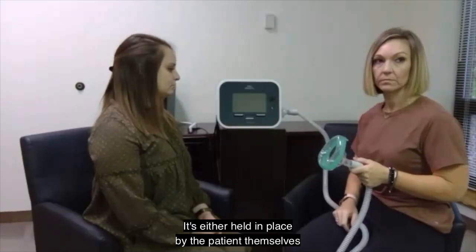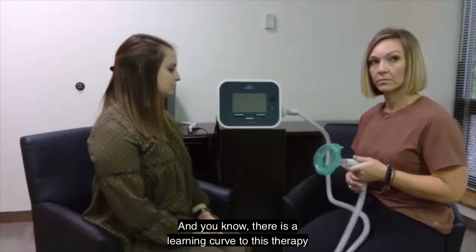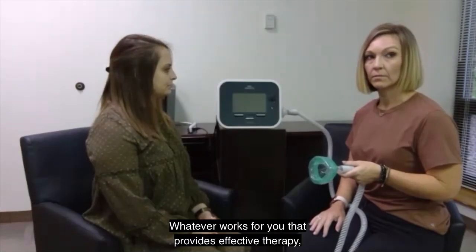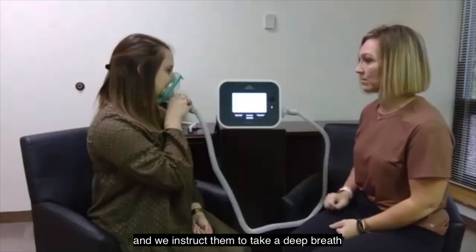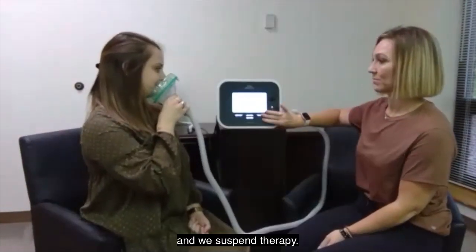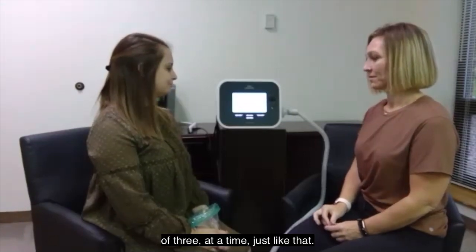We don't strap this on to anybody. It's either held in place by the patient themselves or by the caregiver — either will work. There is a learning curve to this therapy, both in terms of how to use it, when to use it, and what's comfortable. Everybody develops their own sort of methodology. We place the mask on the patient's face and instruct them to take a deep breath and cough out. That's repeated, and then we have them remove the mask from their face and suspend therapy. That's one set of three. Generally, we encourage people to do three sets of three at a time.